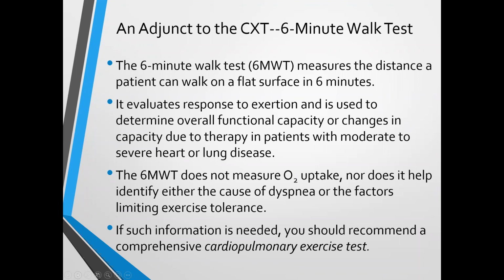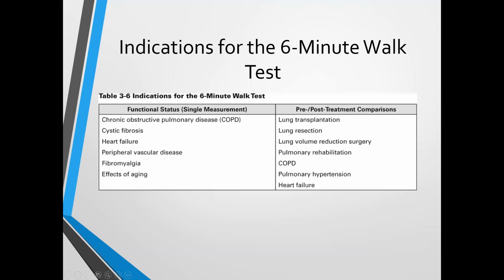It does not measure a lot of these specific discrete measurements that we just talked about in the cardiopulmonary stress test. Oxygen uptake, CO2 production, no. METs, no. If such information is needed, again, the cardiopulmonary exercise stress test would be what should be done.